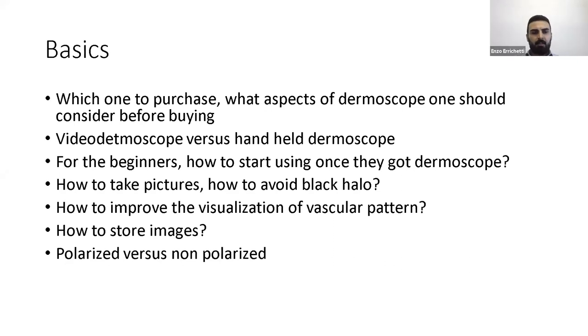Yeah, I agree with you. As I showed you before, we may have Wickham striae and pseudo-Wickham striae, which are due to the fibrosis. With polarized dermoscope, the pseudo-Wickham striae, which are due to fibrosis, appear brighter with the polarized setting. So, of course, it is very important to use the polarized setting to differentiate the white color due to hyperkeratosis, hypergranulosis, and the white color due to fibrosis.